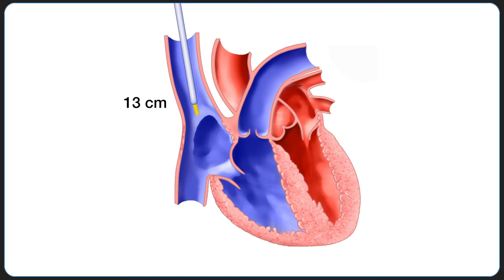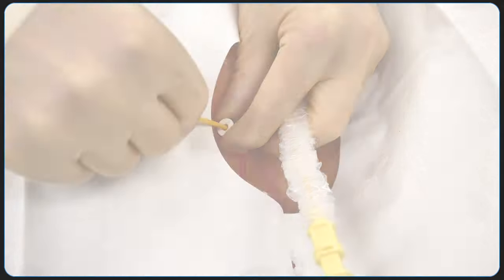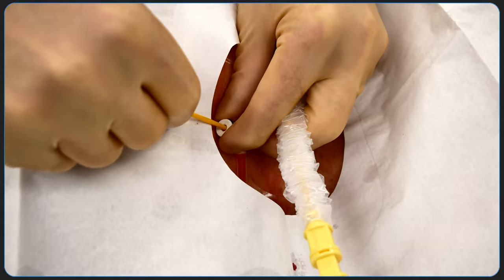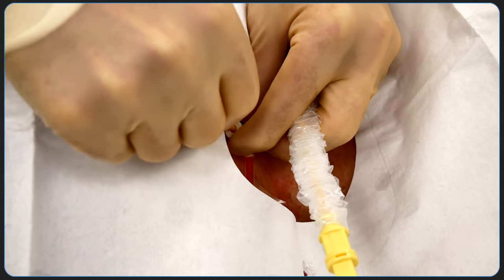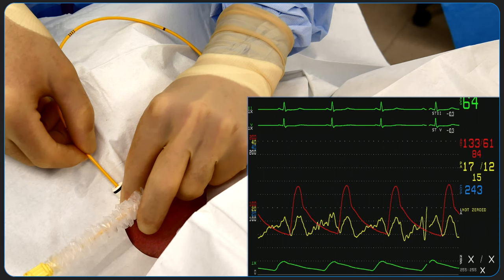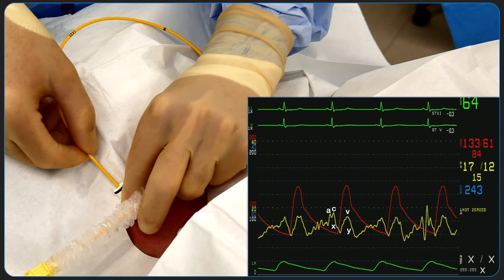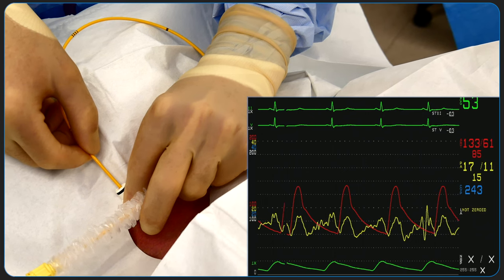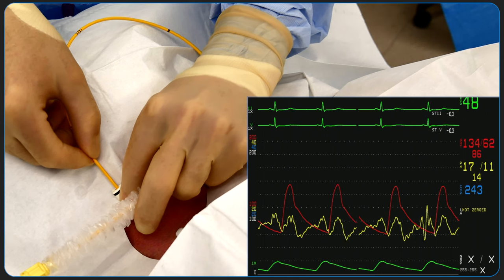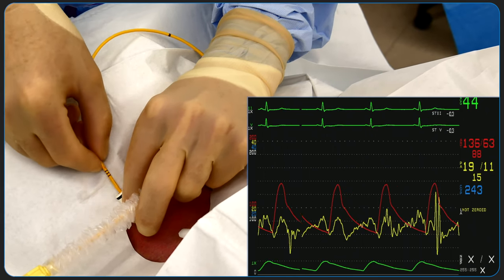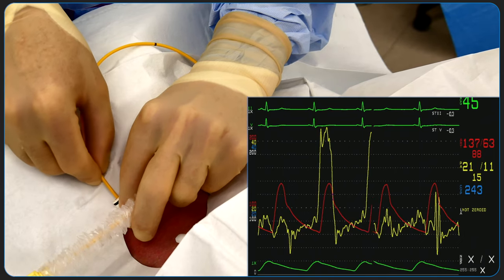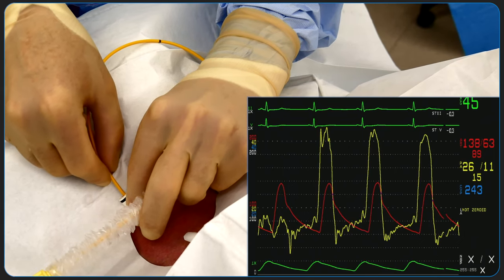The tracing on the monitor should be observed carefully at all times. The PA catheter balloon is inflated and the catheter is advanced with a deliberate motion with each heartbeat. The PA catheter is at 20 cm with the balloon deflated and the waveform visualized in yellow is that of the central venous pressure, as the tip is in the right atrium. As the balloon is inflated, the PA catheter is advanced. The abrupt change in waveform suggests that the catheter has now traversed the tricuspid valve into the right ventricle.